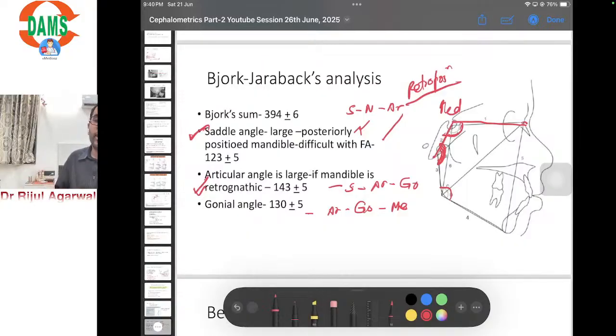Again, the myofunctional appliance therapy is a failure. And lastly, the gonial angle. Gonial angle is very simple. It indicates the growth pattern. If it's a vertical growth pattern, the mandible is rotating downward and backward. If you position it forward, the myofunctional appliance therapy will fail.